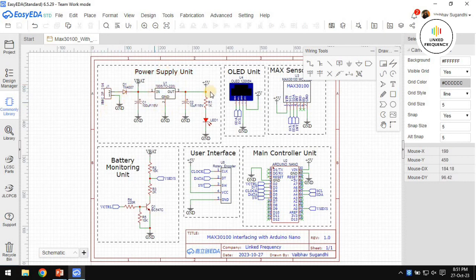And after that, we have a 7805 which will convert the 8.4 volt or 7.6 volt coming from the battery into a 5 volt DC. And then we have an OLED module here and a MAX30100 module here. Directly we are using a module, and then we have a user interface rotary encoder module here. This is the voltage divider circuit which we discussed in our previous tutorial, and one of the wonderful circuits that I use in most of our projects. In industry also, people use it more often in every project wherever a battery is included.